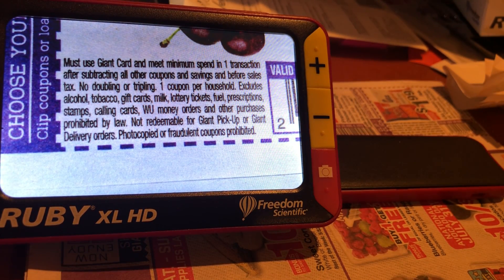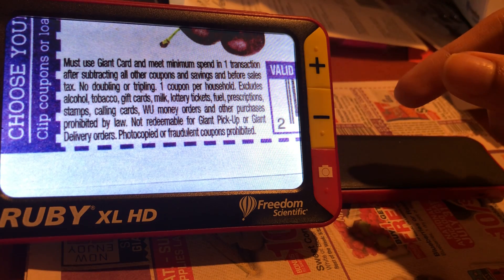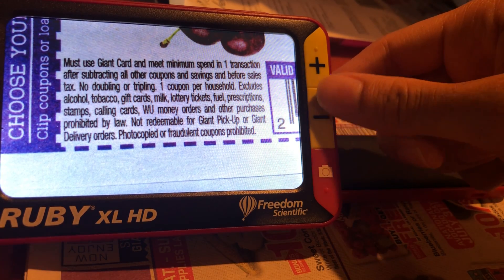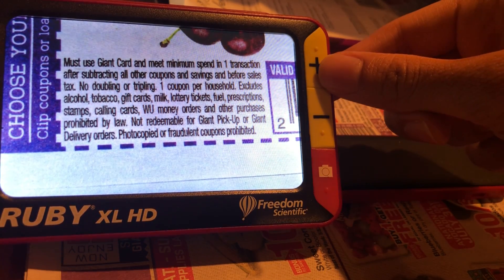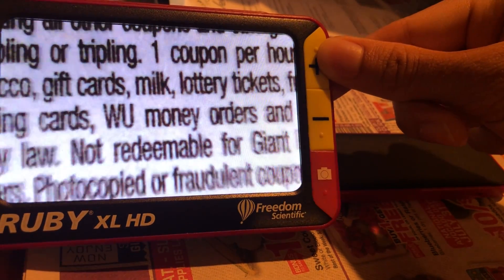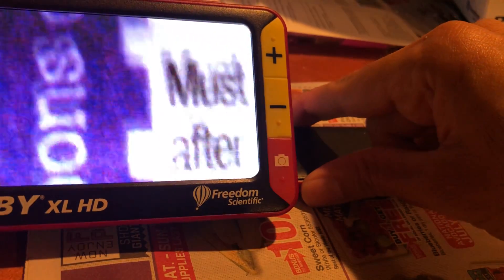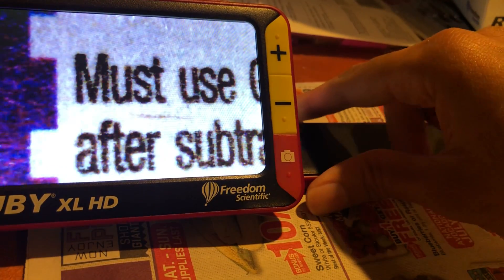The Ruby is capable of up to 14x zoom. Right now we are in 2x zoom. The zoom can be adjusted by pressing the plus or minus buttons on the top right of the device. If I hold the plus button, it goes right into the small text of the coupon.